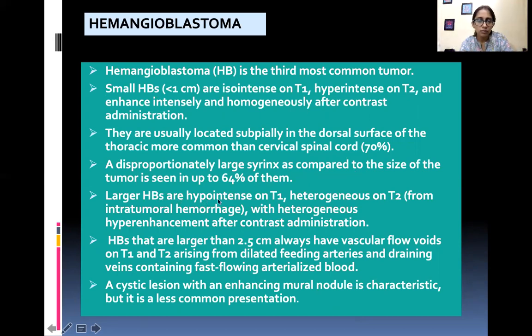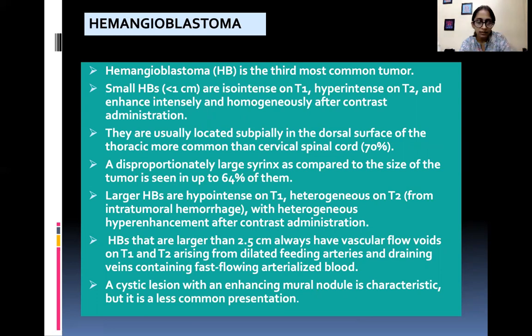Larger hemangioblastomas are hypo intense on T1 and heterogeneously hyper intense on T2 from intratumoral hemorrhage, with heterogeneous hyper enhancement after contrast administration. Hemangioblastomas larger than 2.5 centimeters have vascular flow voids on T1 and T2 arising from dilated feeding arteries and draining veins containing fast-flowing arterialized blood. A cystic lesion with an enhancing mural nodule is characteristic but a less common presentation.